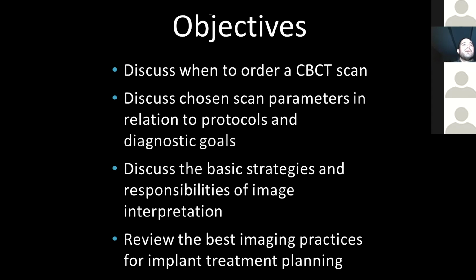Start talking with reps, because while field of view is a common starting point and where I say you need to start with deciding on a unit, technical support, software integration, image quality, and on top of software integration, workflow integration with the rest of your imaging software. If you're doing implants, any sort of implant software are really, really important. So you have to look at all of those in aggregate. It's a process to find the right one. Don't be afraid of buying 2 units if you find that the one jack-of-all-trades unit for other reasons doesn't meet your needs.